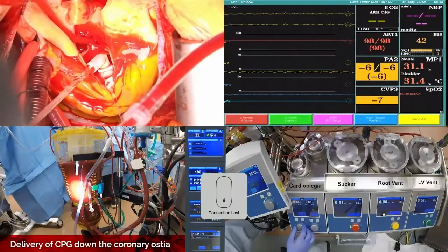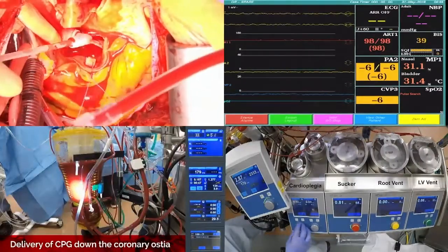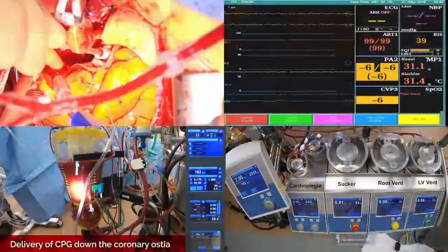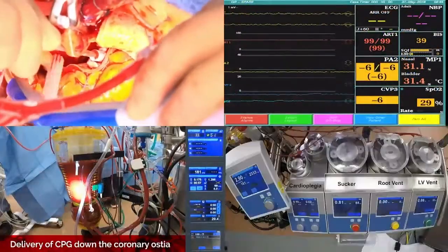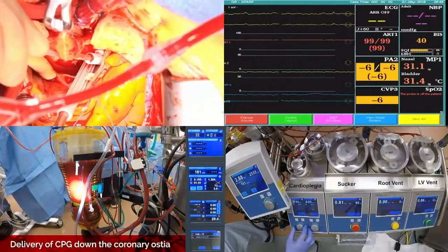Yeah, because if you're giving antegrade cardioplegia on a patient with aortic insufficiency, a lot of that cardioplegia is going down into the LV, the left ventricle. It's not going down the coronaries. It's waste. And this shot down there really, I think, helps a lot, because retrograde just does not work as well, especially in your sicker, thicker ventricle patients.